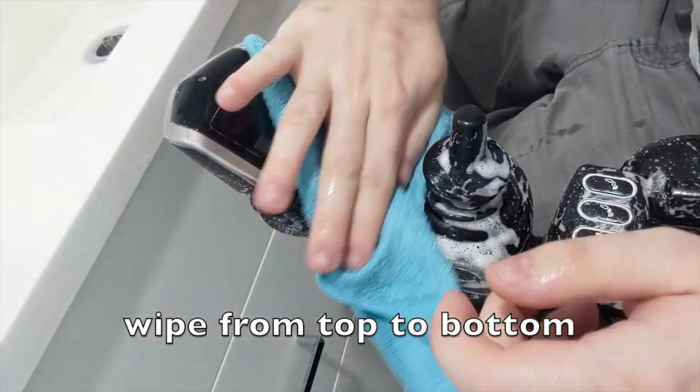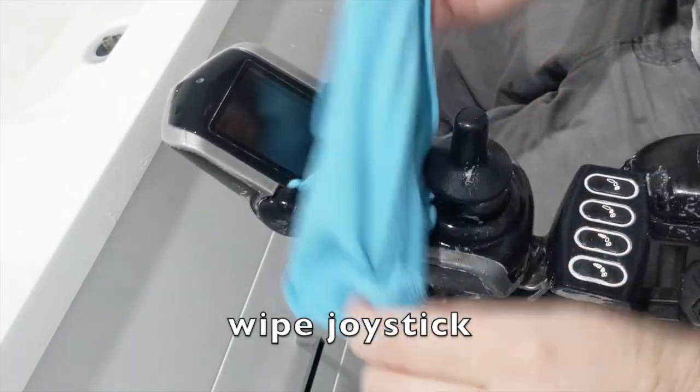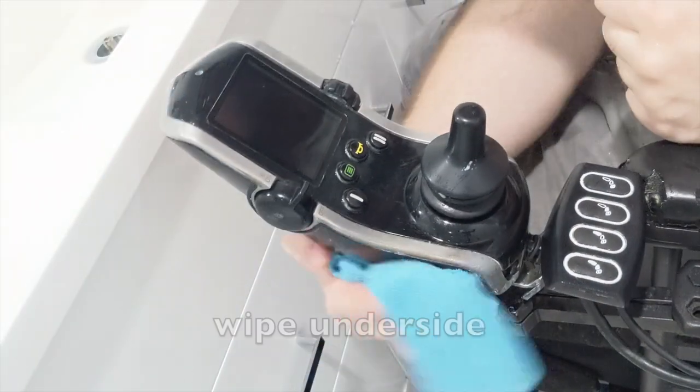Rinse the cloth, then wipe from top to bottom again. Wipe the buttons and joystick, then the underside and armrests.